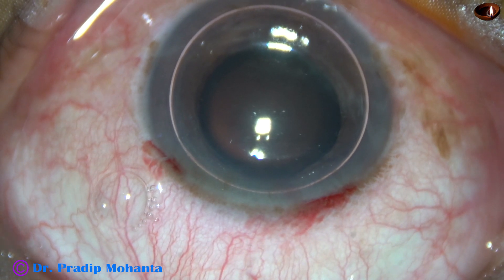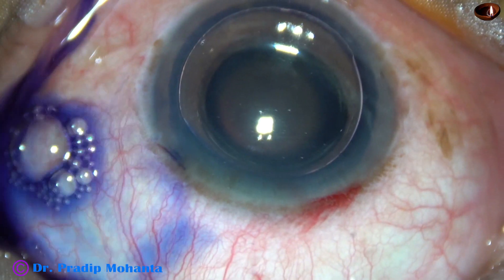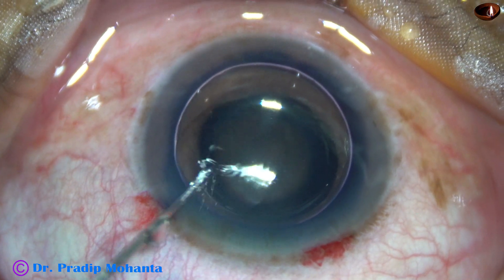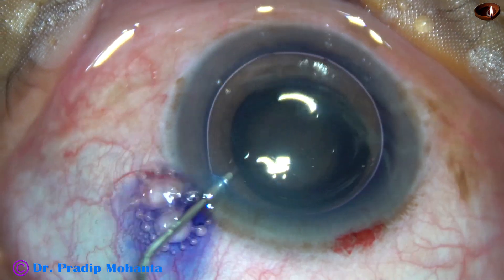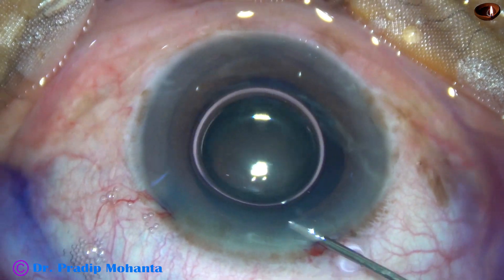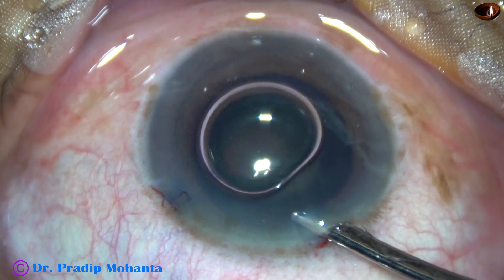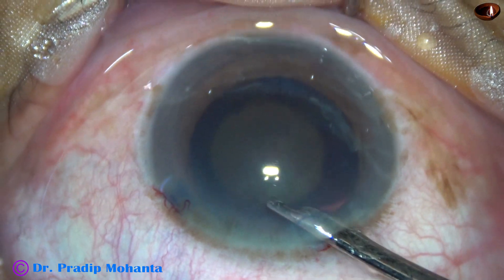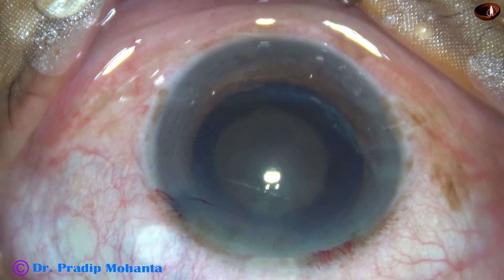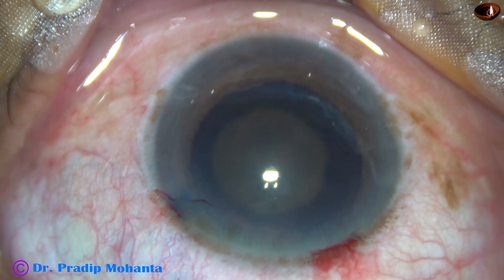An air bubble has been injected into the anterior chamber. And now, trypan blue dye is applied over the anterior capsule, underneath this air bubble. This is a bit of adrenaline. I want to see if the pupil dilates a little more after application of this adrenaline. And the adrenaline helped in this case. The pupil dilated a little more. And if this dilatation remains throughout surgery, there will be no problem.